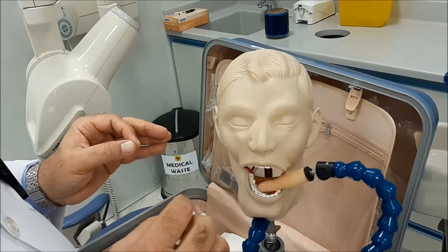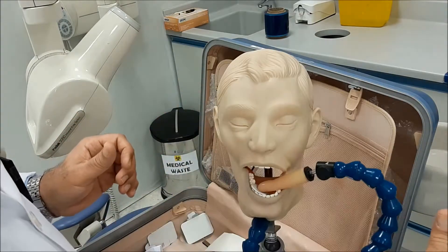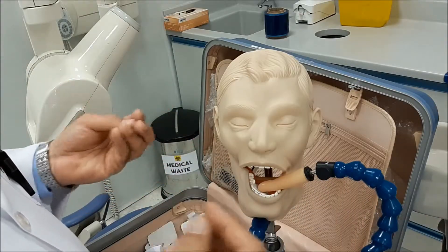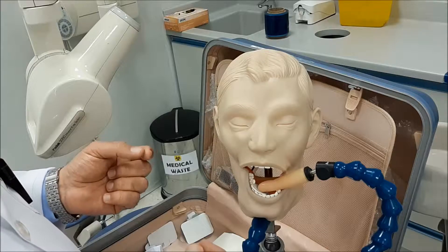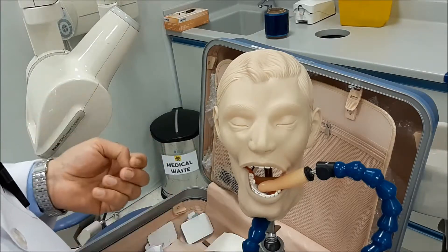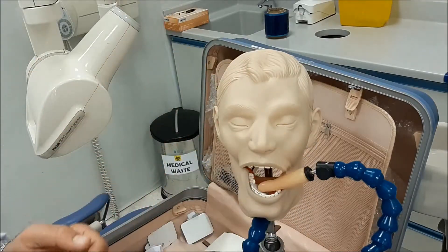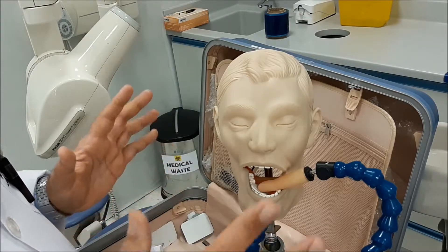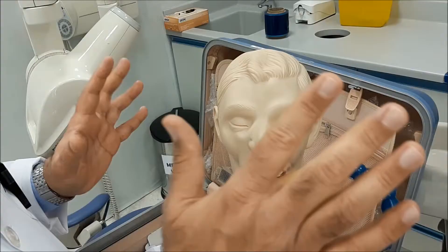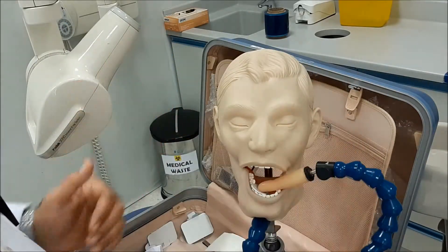Most patients, when you tell them to support, will press very hard. These sensors are very light in weight — only about 20 to 22 grams. So you don't need a huge force to support; it's just a matter of preventing the slippage of the sensor from its location. Tell your patient in advance that they don't need to press very hard — just support the sensor in place so that during the exposure it will not move.